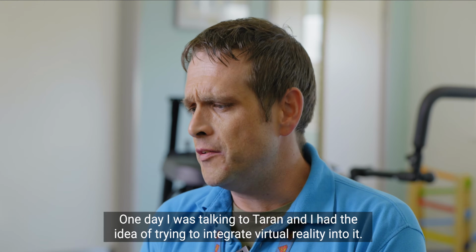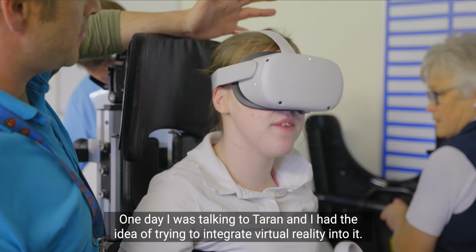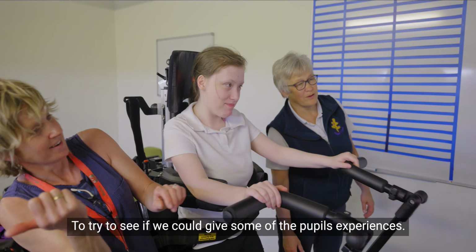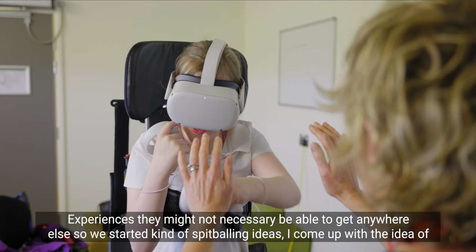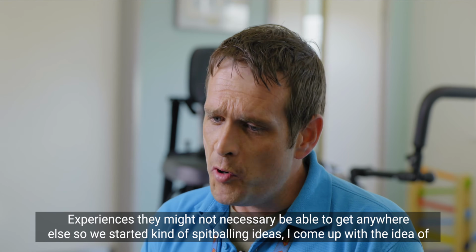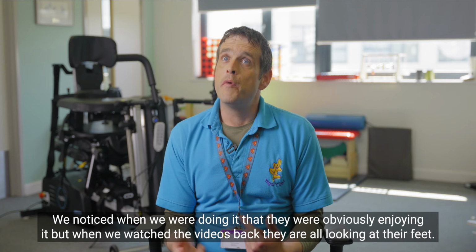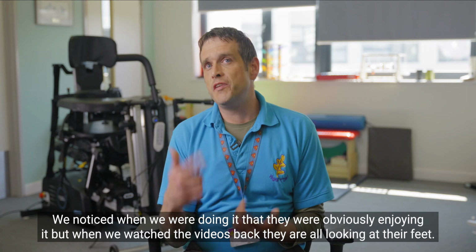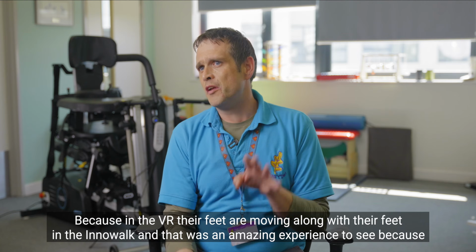One day I was talking to Taryn, and I had the idea of trying to integrate virtual reality into it to see if we could give some of the pupils experiences they might not necessarily be able to get anywhere else. So we started spitballing ideas, and I came up with the idea of simulating walking. We noticed they were all obviously enjoying it, but when you watch the videos back, they're all looking at the feet, because in the VR, the feet are moving along with their feet in the Innowalk.